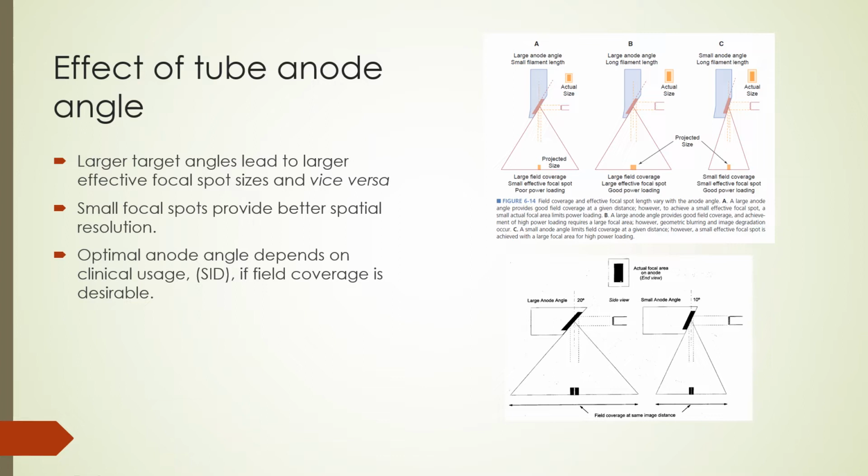For a large field coverage and good power loading, a large filament will be used, but the effective focal spot will be large, meaning there is geometric blurring and image degradation. So all these factors have to be balanced for the clinical task at hand.